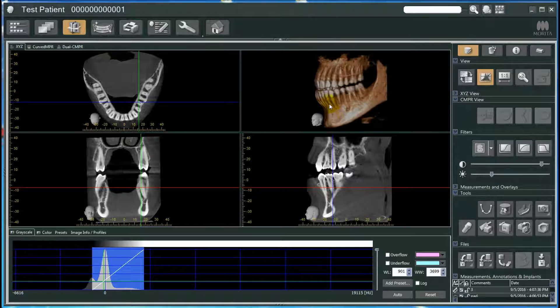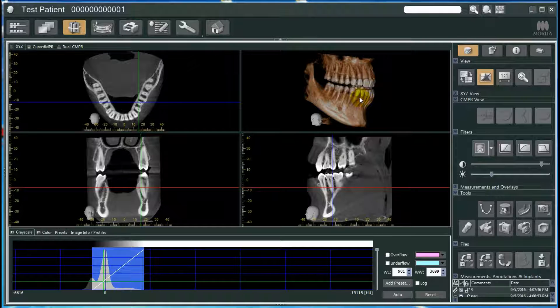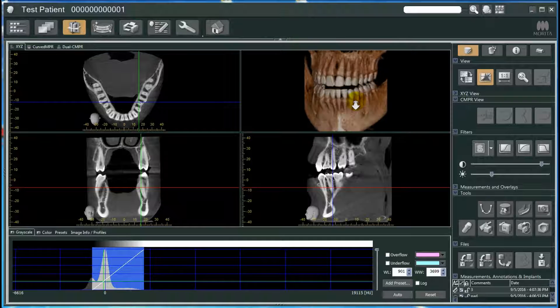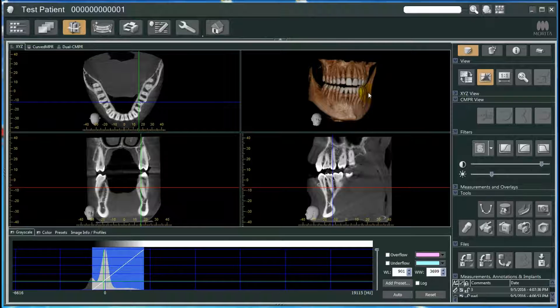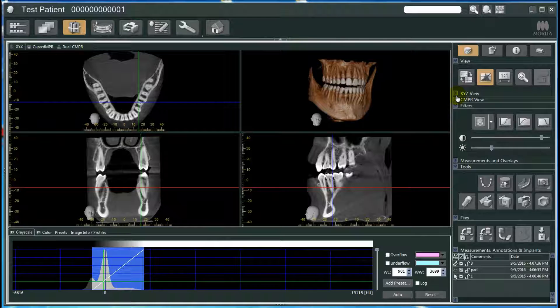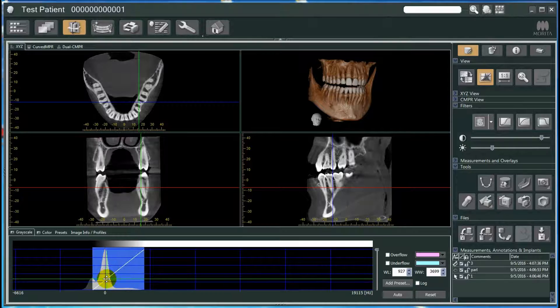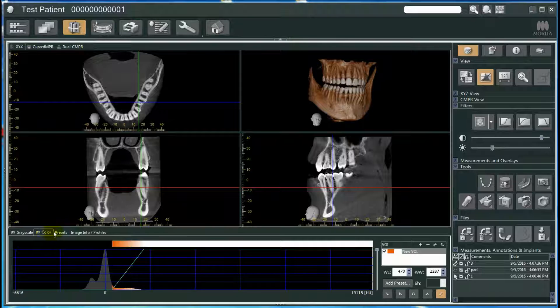I apologize if my computer is running a tad slow — the recording software is slowing it down a bit. You can zoom in and zoom out on the 3D rendering, which gives a nice wow factor to show patients. On the lower bottom we have our histogram, and on the right side panel we have all of our tools and functions. My workflow usually starts with the histogram — I make sure my contrast and brightness is where I like it. You can adjust this however you want, moving brightness and contrast until you have it where you want it.